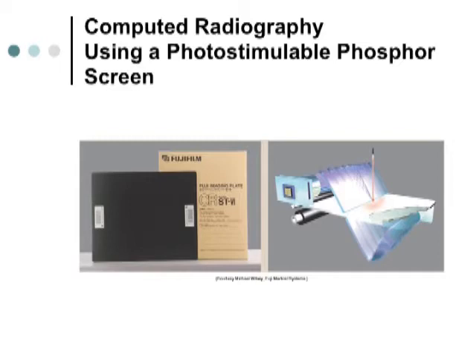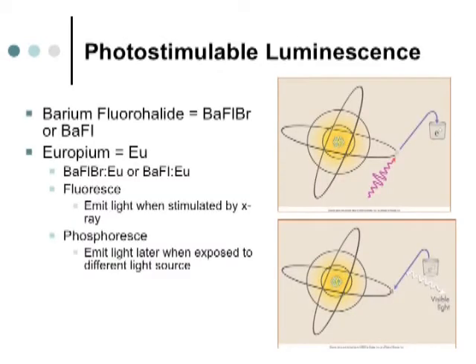On this plate, we have these phosphors that are called photostimulable phosphors. Photostimulable. So they can be stimulated by laser light. So it's a red light that stimulates these phosphors, not white light. So on these plates, they're made out of various elements, but barium fluorohalide has bromide in it. These are activated by the X-ray.